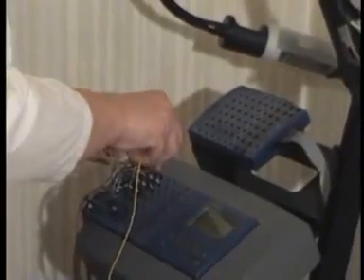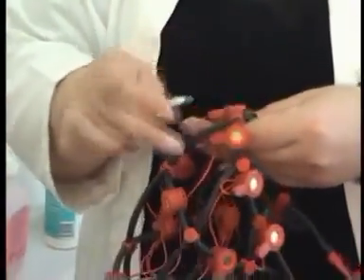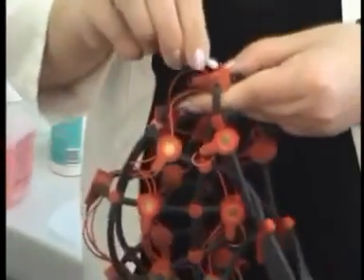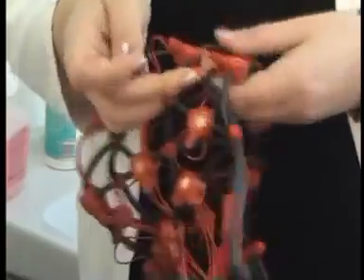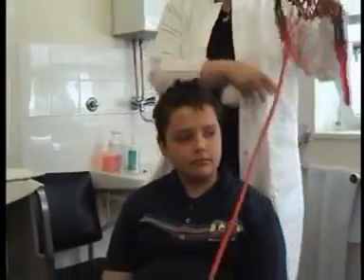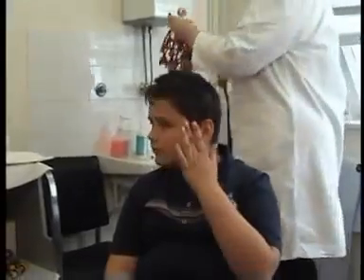Please let me offer a few important tips about the maintenance of the COMBY EEG cap. It is necessary to clean the electrodes with a cotton wool stick soaked in alcohol before the cap's first use or after a longer period of time that the cap has not been used. After finishing the daily recording session, the cap should be washed with a solution of warm water and liquid disinfectant detergent. Rinse it, dry it with a towel, and leave it to dry till the following day.